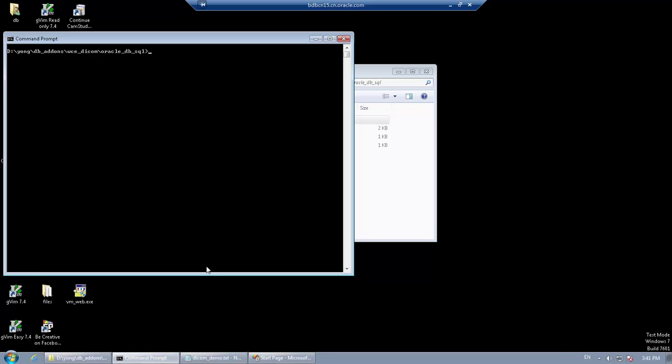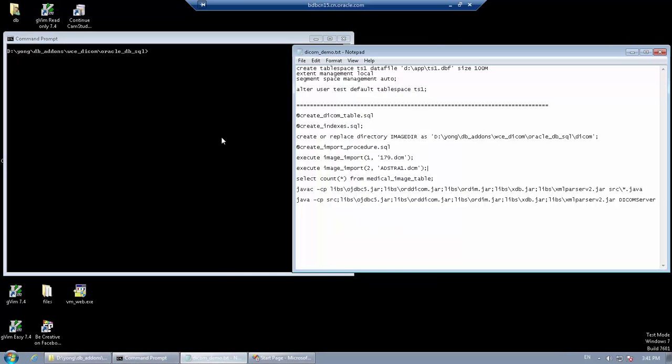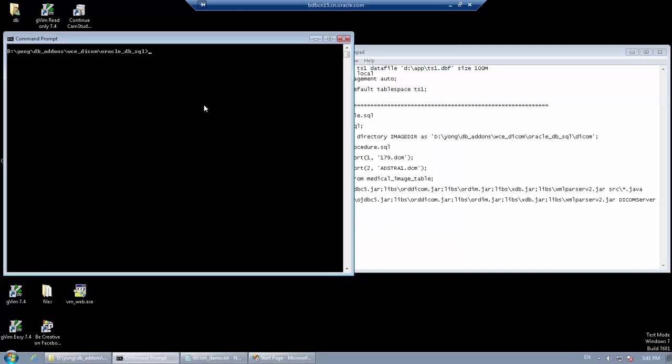Since we are going to execute scripts from files, it is convenient to start your SQL plus under the Oracle DB SQL directory.